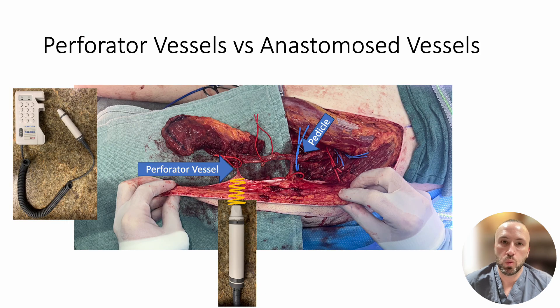With the handheld Doppler, we are checking the smaller perforator blood vessels that give blood supply to the flap skin. These are much more superficial than the main blood vessel pedicle we connected with the surgical microscope.